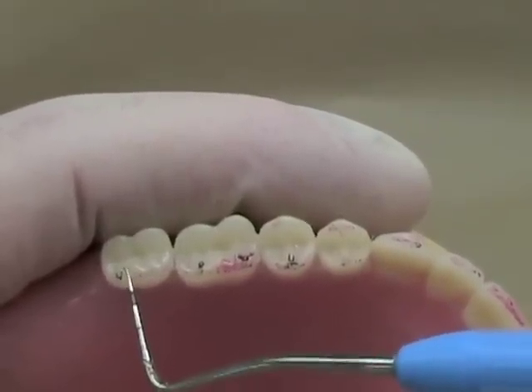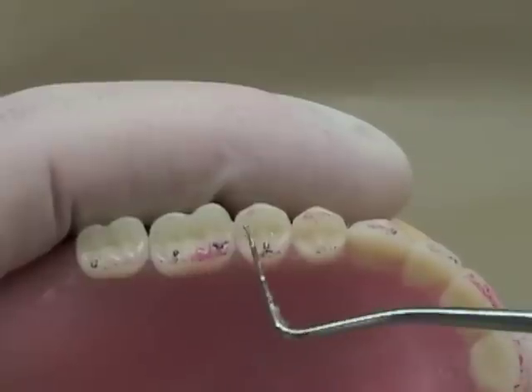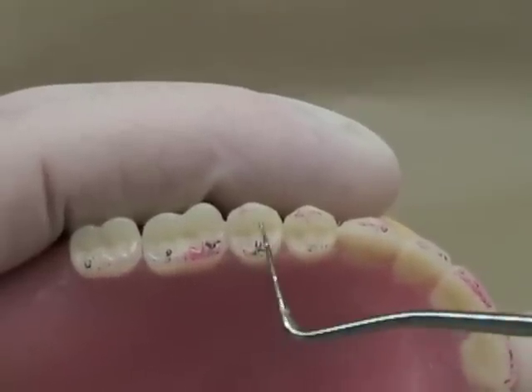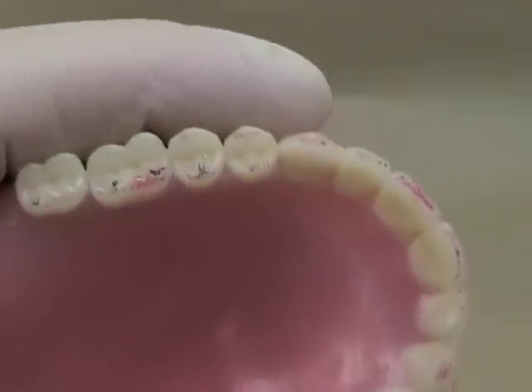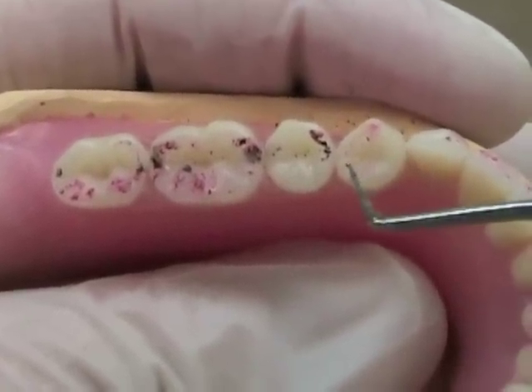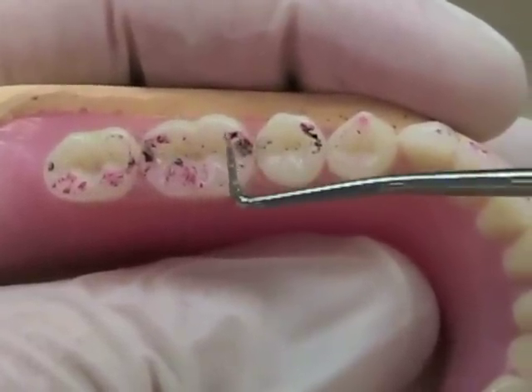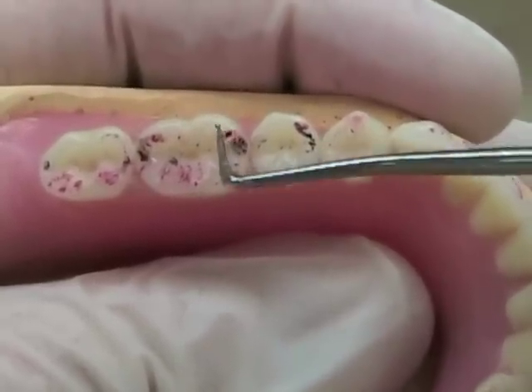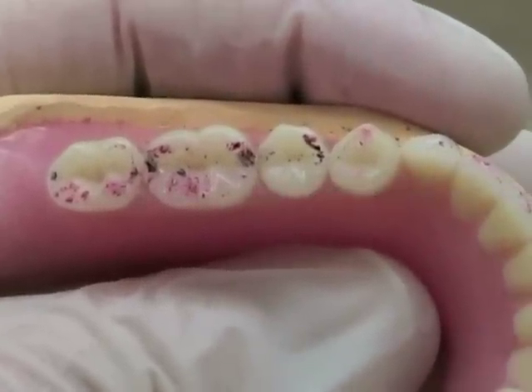In this particular case, you can see we've got one contact on the second premolar, two centric stops on the molar, one on this premolar, and this premolar doesn't really have a good contact. We could probably adjust the opposing fossae just a little bit to make sure that this contact becomes more even. If the contacts are present but not in the place you'd like them, you may need to adjust the teeth — for instance, here we have a black centric stop marking slightly buccal to the central portion. We would adjust this area so that the only contact is in the central fossa.